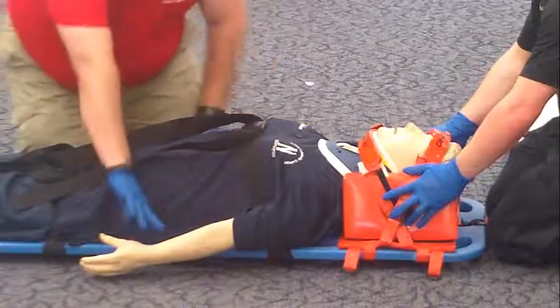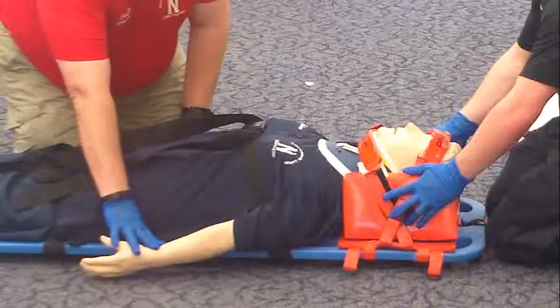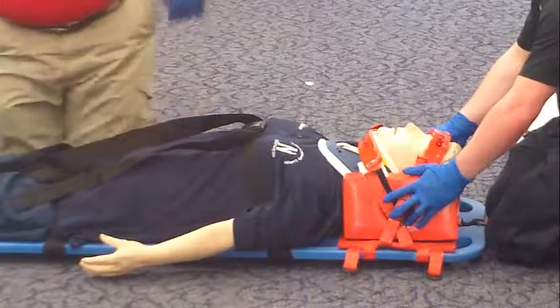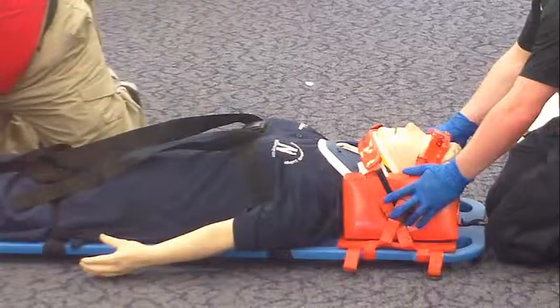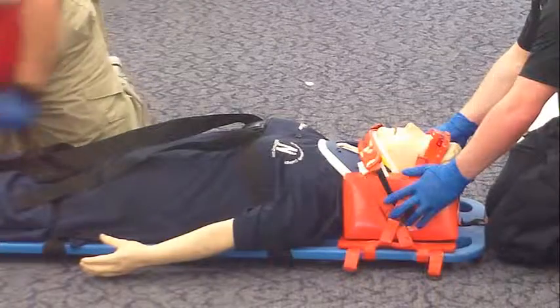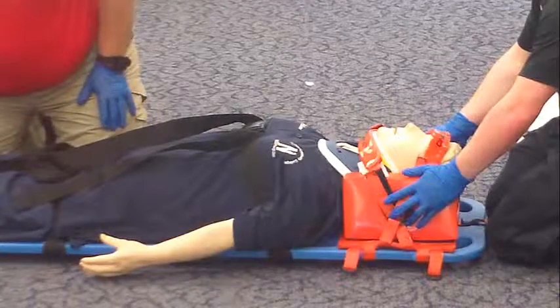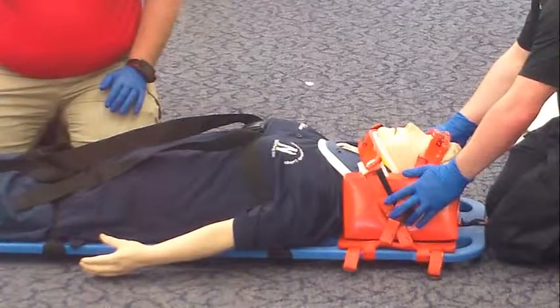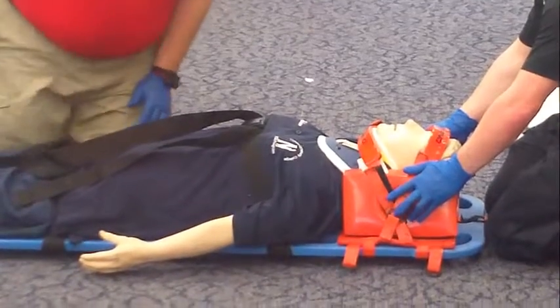I will now check pulse, motor function, and sensation in all four extremities. Pulses are present. Can you feel this? Can you wiggle your fingers? The response is yes. Check the pedal pulse — do I have pulses in the feet? The pulses are present. Can you feel this? Can you wiggle your toes? The response is yes. At this point in time, I will load the patient onto the stretcher and I am done with this station. Thank you. Good luck with your other stations.